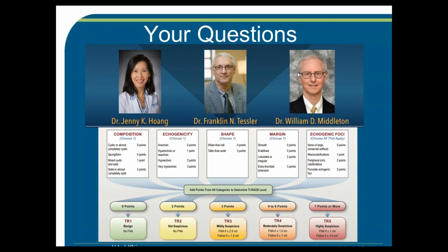I think that for pediatric patients that are close to the adult range, it's probably reasonable to apply ACR TI-RADS. But once you get to much younger patients who have a higher risk of cancer, I wouldn't say that all bets are off, but you have to be much more careful about calling nodules benign or saying they don't need follow-up based on ACR TI-RADS. And there are several publications in the literature that address how to manage pediatric patients with thyroid nodules.